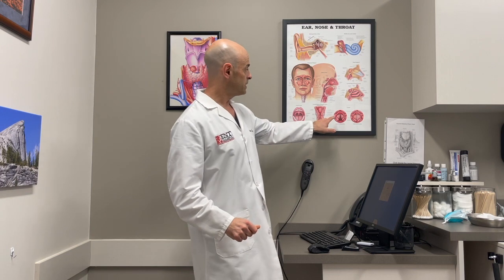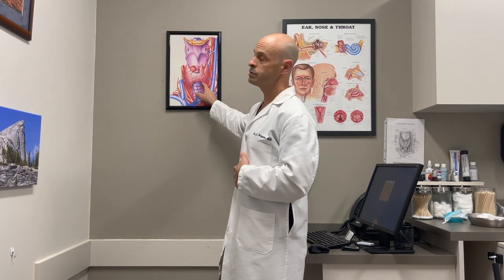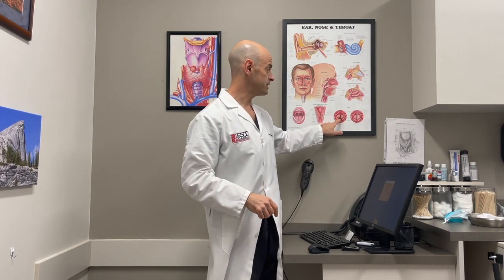Because of that, we're able to use a special breathing tube, endotracheal tube, that has a little sensor on it. And the sensor sits right at the level of the vocal cords. This allows us to perform this nerve monitoring technique, whereby you identify the nerve and you touch the nerve with a little stimulator, which sends a teeny electrical impulse up the nerve to make the vocal cord on that side twitch. The twitch will be detected by the sensor, and it's connected to a monitor on the side of the room, which will essentially make a beeping noise.